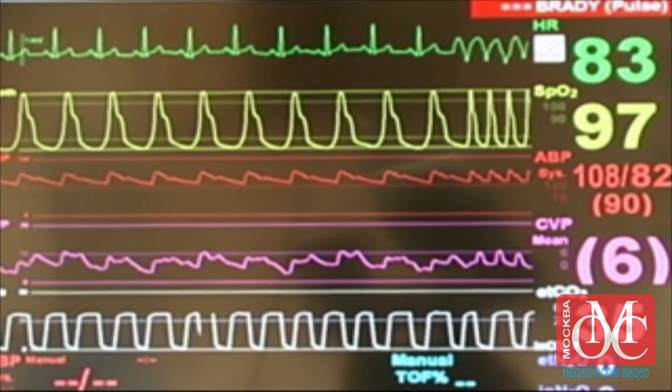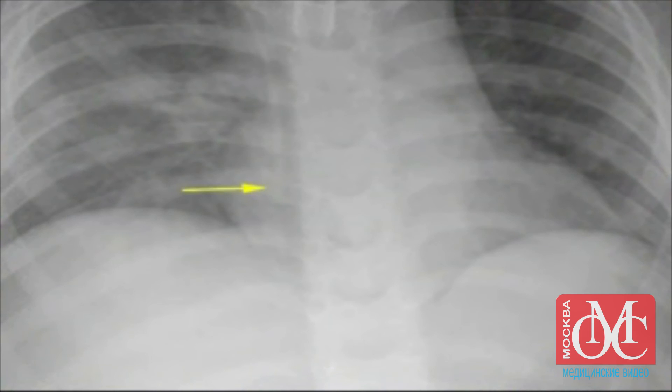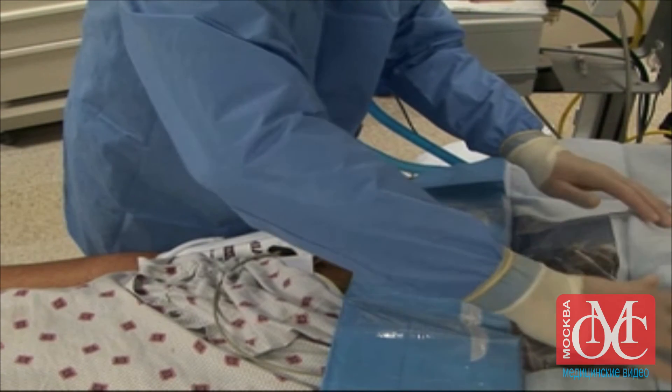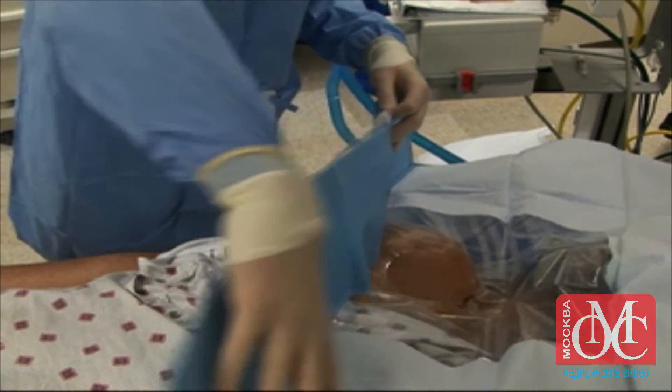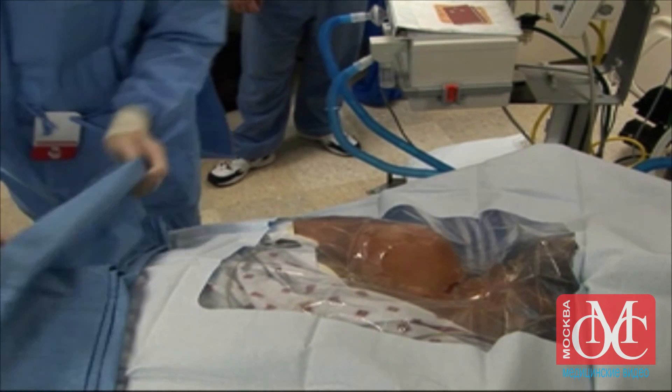If arrhythmias are seen on the monitor, the line may be in the heart, in which case the line will need to be pulled back. By approximating the necessary length of the wire before catheterization and confirming its placement with a chest x-ray, this problem can be avoided. Always be sure to work within a sterile field when placing a central venous line and to keep the site clean after placement to prevent local or systemic infection.